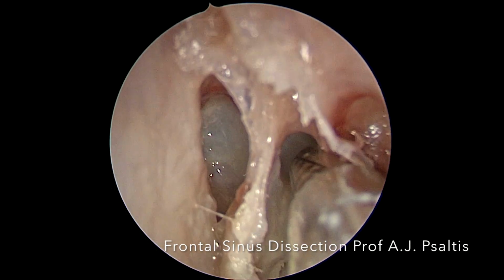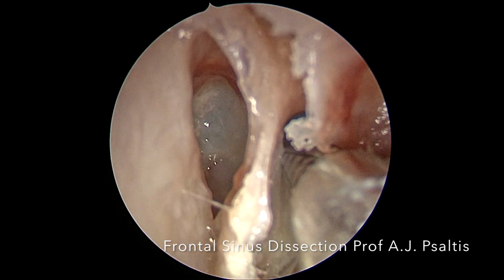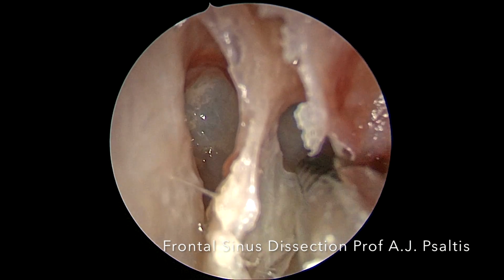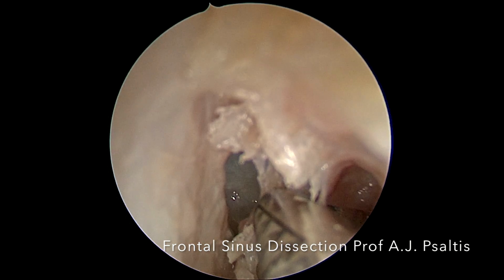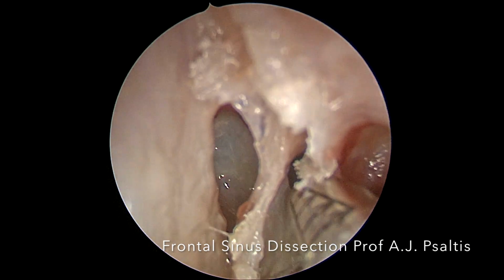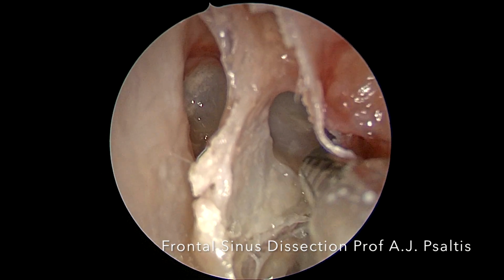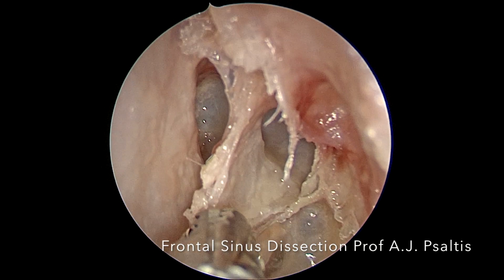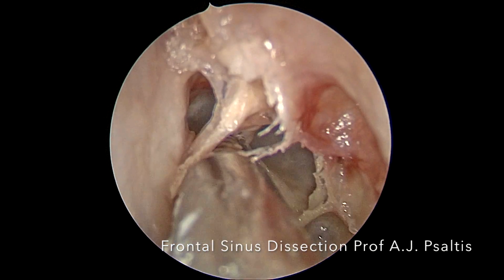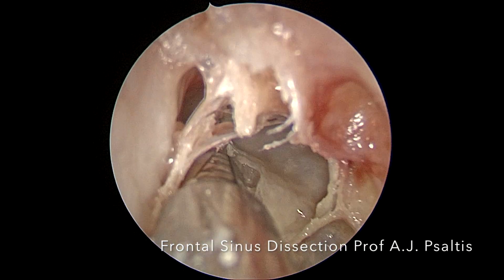Once we are happy that we have obtained the frontal sinus ostia, we can then proceed to enlarge the ostia laterally out towards the orbit and medially fracturing the intersinus septal cell. This is important to maximize the diameter of the frontal sinus. Again, caution needs to be exerted to prevent mucosal stripping, which will ultimately affect the size and healing of the frontal sinus.